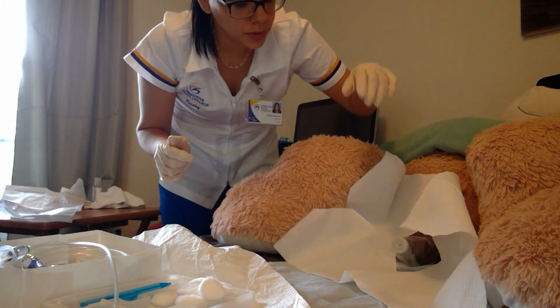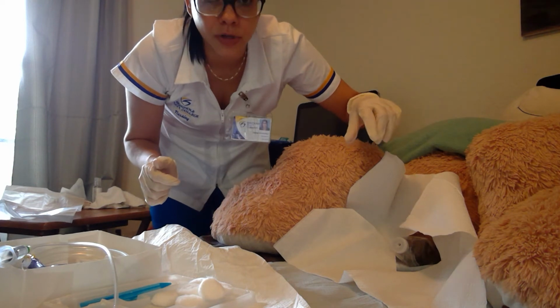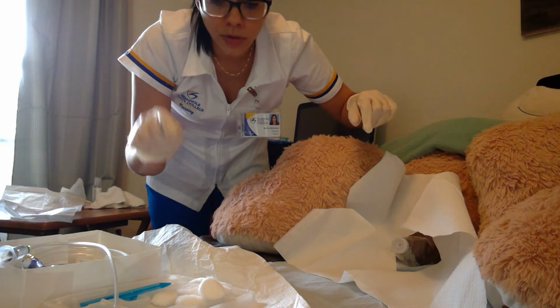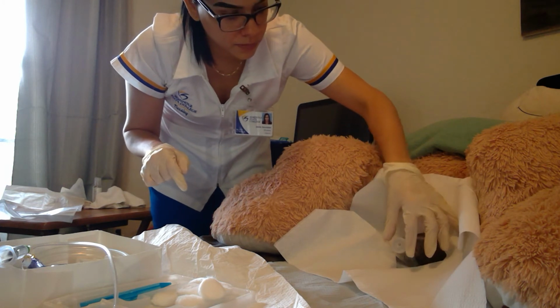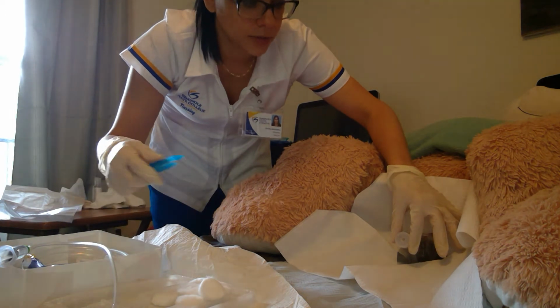So what I'm going to do is I am going to open her labia and expose her urethral meatus, and I'm going to clean that area with the solution that was in the tray using my forceps and my cotton balls. Okay? Okay, do it. Now this hand is contaminated.